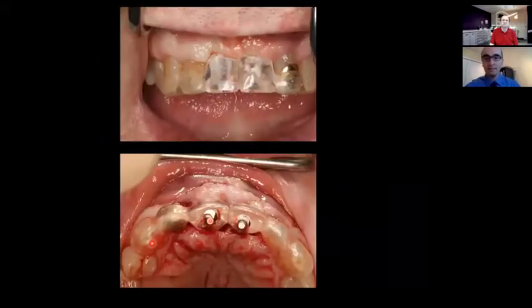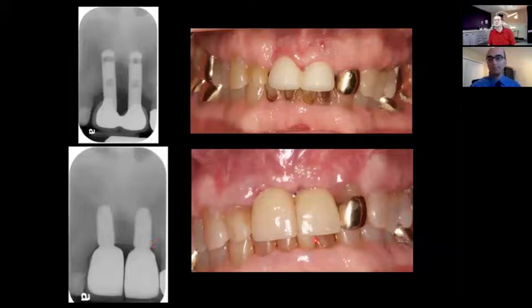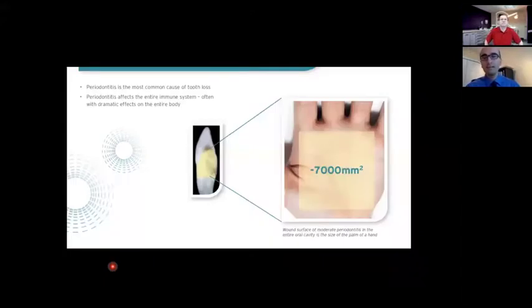My surgical stents and my guided drills to insert two implants. The implants have been placed in a restoratively driven way, and certainly my colleague has placed these two implant crowns. We established the health around these two implants by providing adequate bone and starting again. As I said, peri-implant diseases are not always manageable by rescuing the implants. There are some cases where it would be significantly better for the patient's health if we take them out and start again. This is something that I want to bring up because it has been shown.